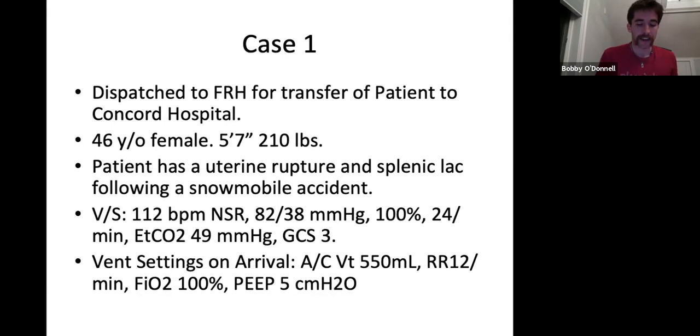Because of that too, their FiO2 needs to come down as well. They have an elevated PaO2. They've been intubated for an hour and their FiO2 is at 100. That's just really poor patient care. They're over-breathing the vent, so we need to take care of their pain.